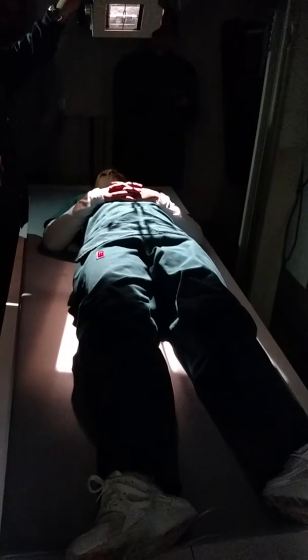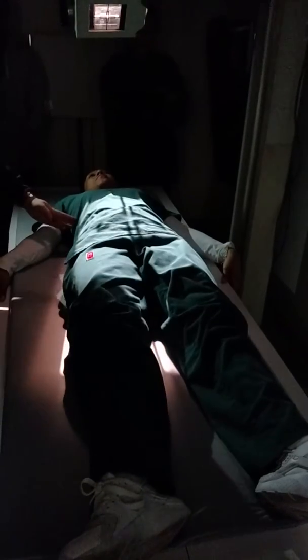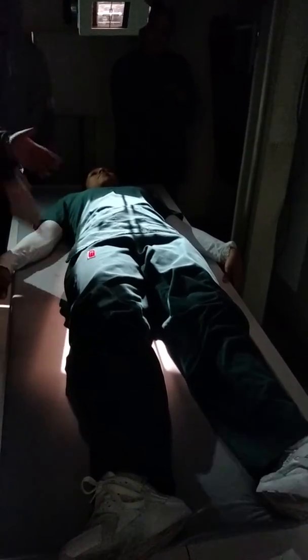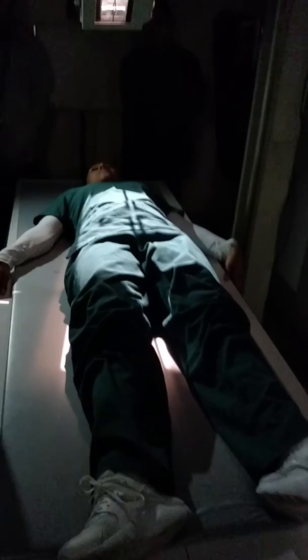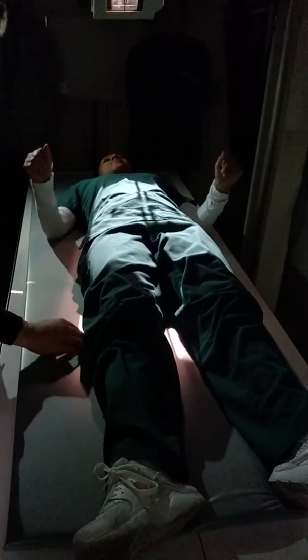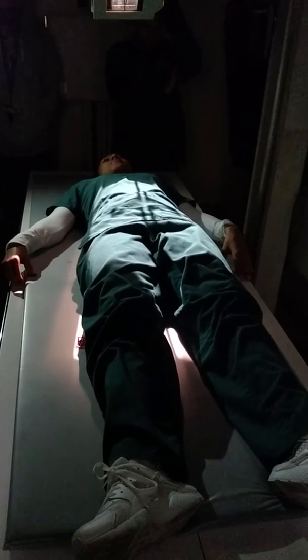And with her, I can collimate because she's tiny. Look at the light. It's all the way like boob to knee. But we know the light's not that big. It's just the angle's distorting it, making it look that way. Where would I put this? That's a good one. I'm going to have to look and see the cassette's right there, so I can stick it there. Hold your breath, beep.